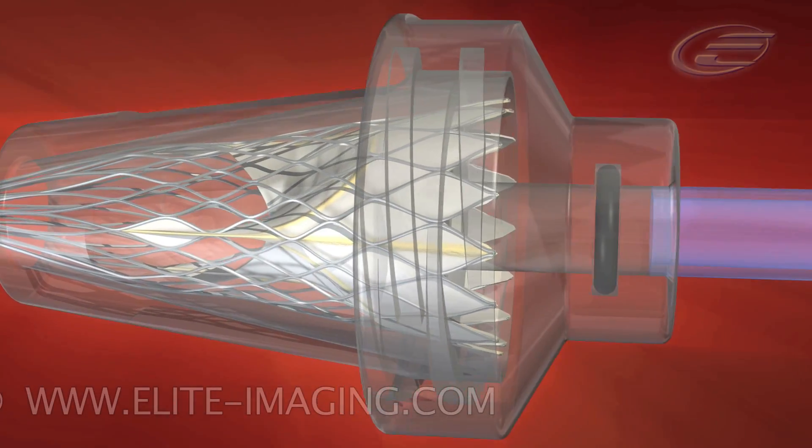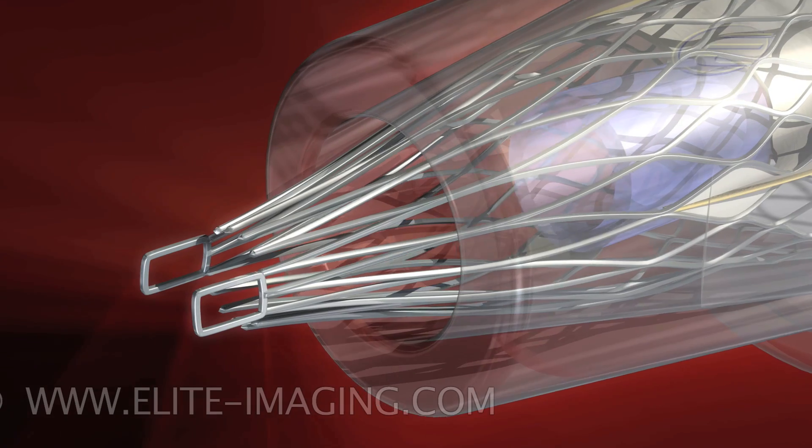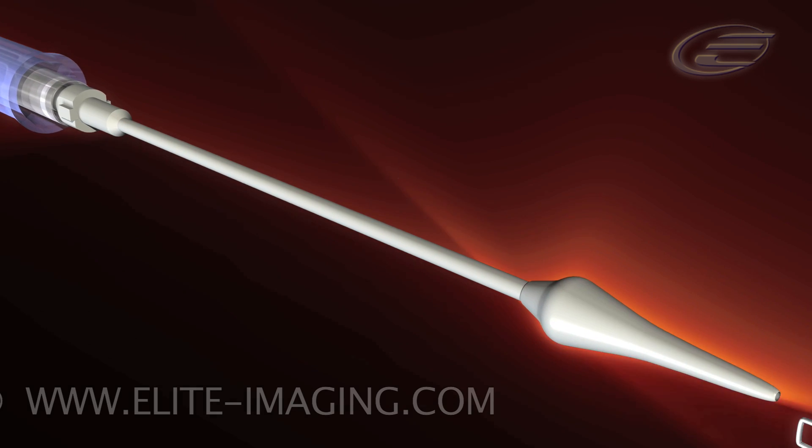Insert the non-tapered inflow tube. Continue to advance the inflow tube until the frame tabs expand. Insert the catheter tip distal end through the outflow aspect.